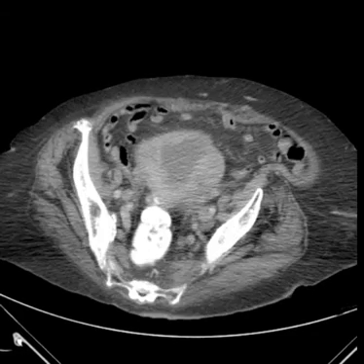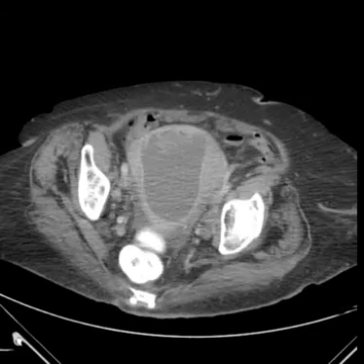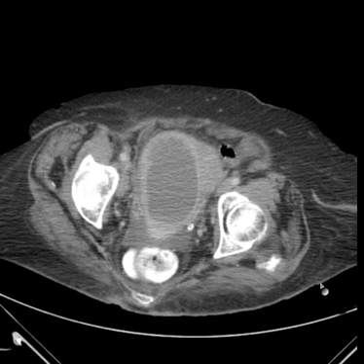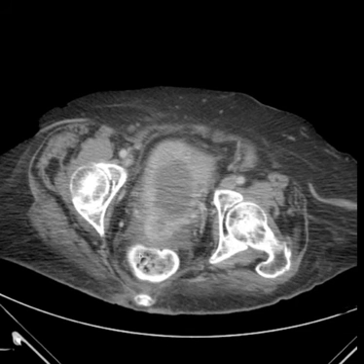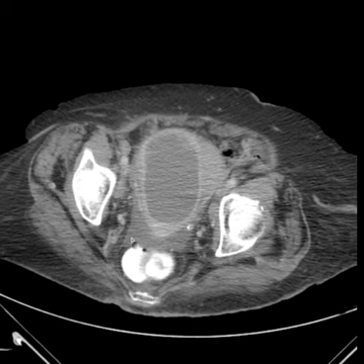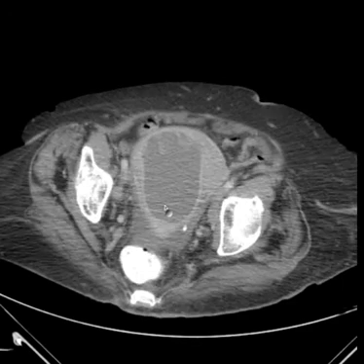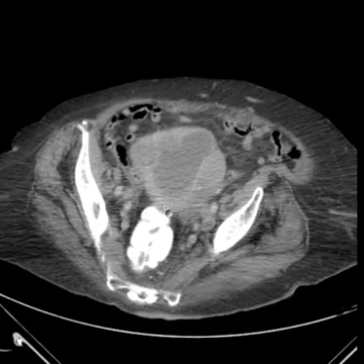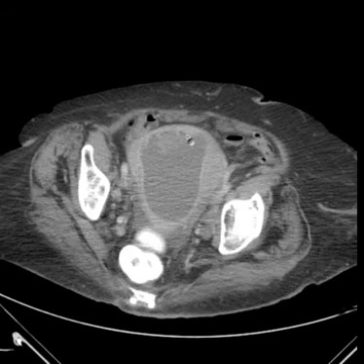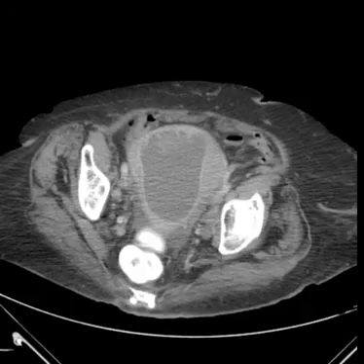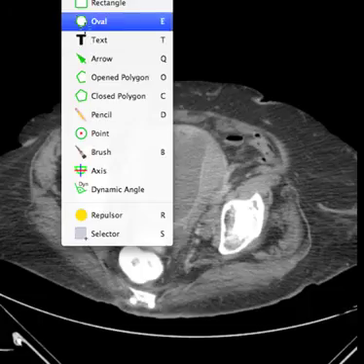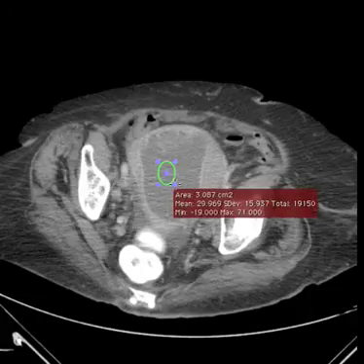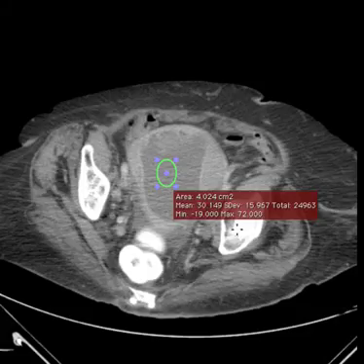Looking down in the pelvis, we see a pretty unusual appearance. First of all, there is some free fluid — not a normal thing in an older woman. And look at this large fluid attenuation area. Where is it? It's in the endometrium. Let's get a quick measurement here: 30 Hounsfield units, so it's a little higher than fluid — low attenuation soft tissue.